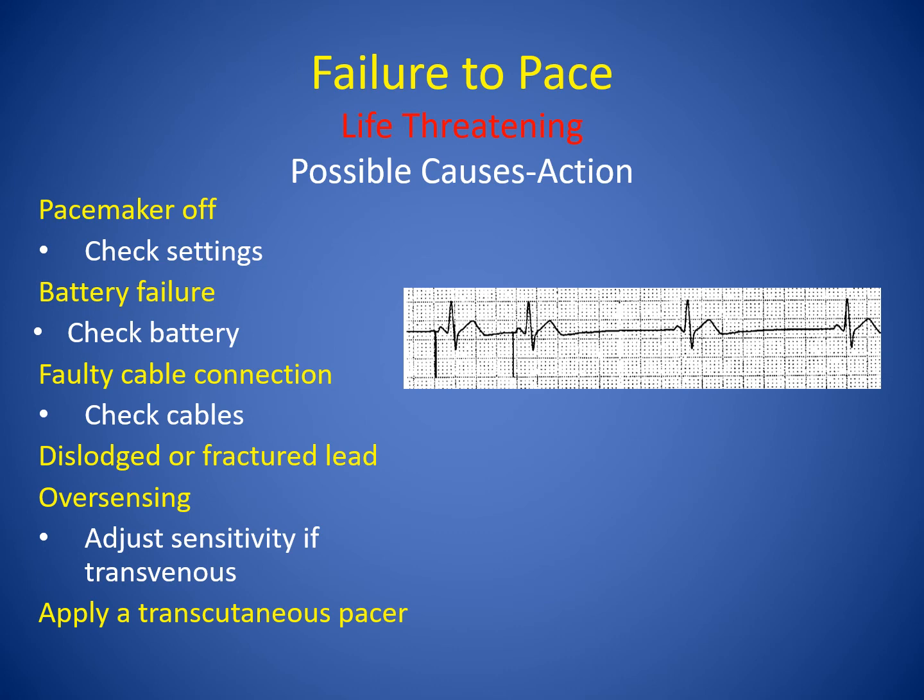The possible causes of failure to pace are usually that the pacemaker is off, so make sure you check your settings. Battery failure, so always make sure you have a fresh battery in there and change it every 24 hours, or if it's a permanent pacer, it would be interrogated and they would be able to see the battery life. It could be due to faulty cable connection. If it's a temporary pacemaker, make sure that the cables are connected and tightened in there. Or it can be due to a dislodged or fractured lead.